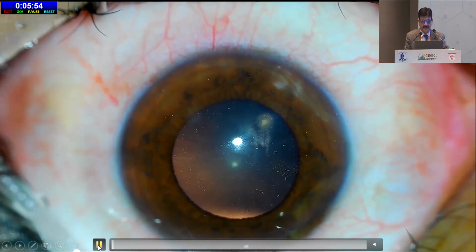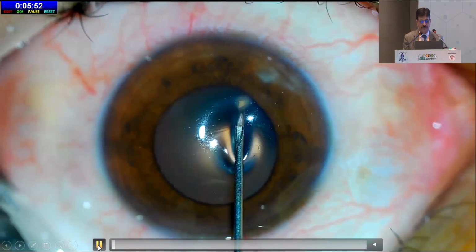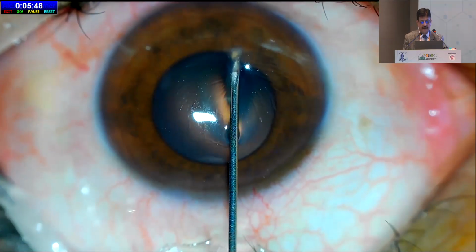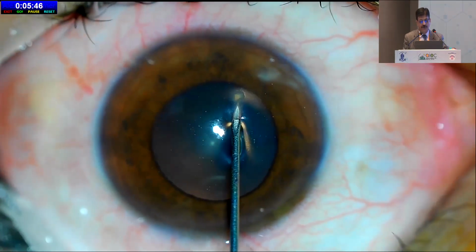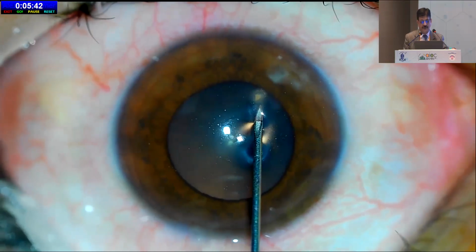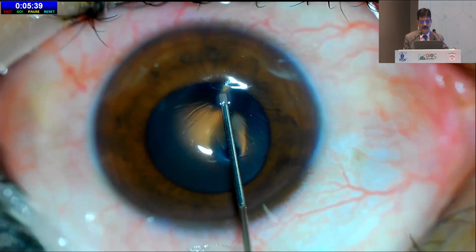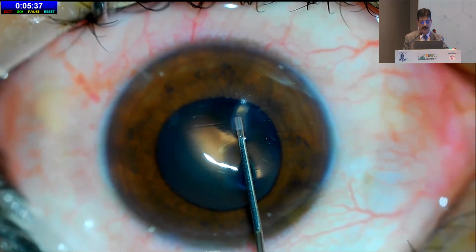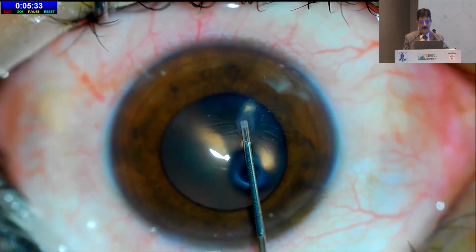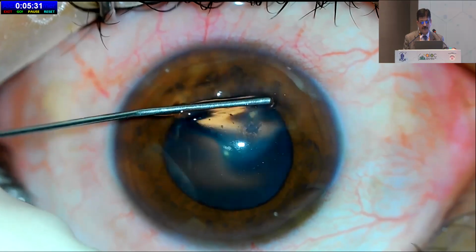Now this patient had a wooden foreign body which was in the anterior and mid stroma, and it was very difficult because wooden foreign bodies we have to remove in toto, otherwise there is no use, because a residual wooden foreign body will lead to fungal infection. So we thought we will widen the track, and we may put some visco or some BSS and it may float out, which is not possible.